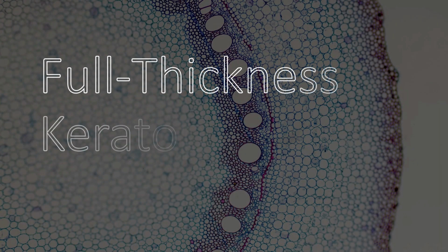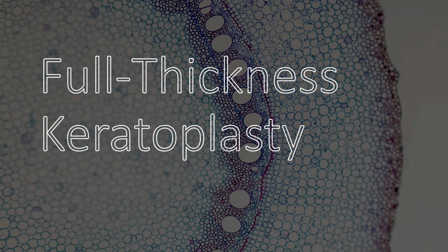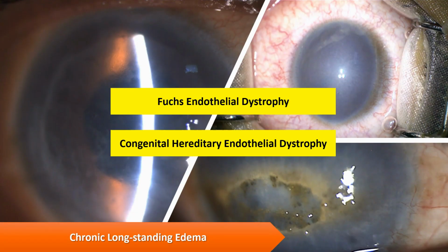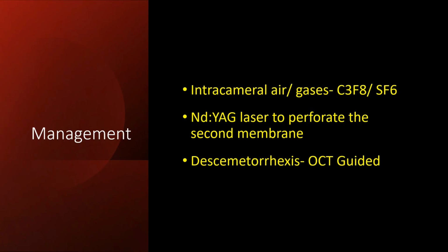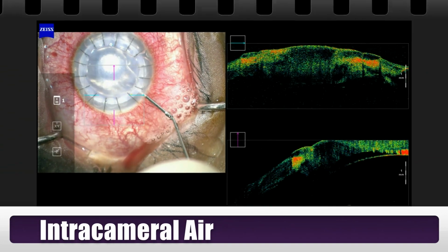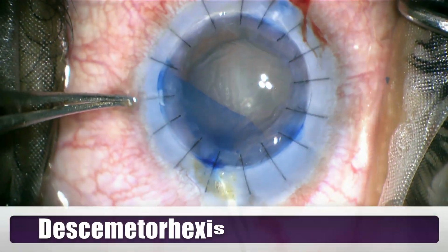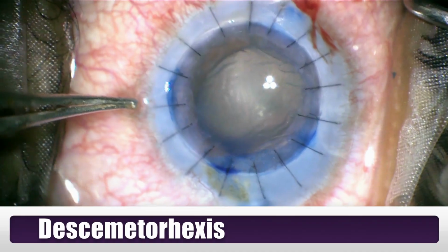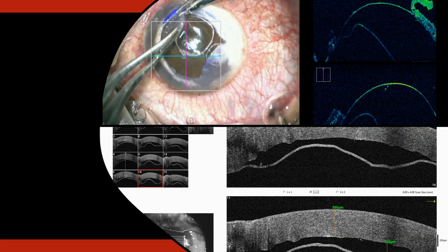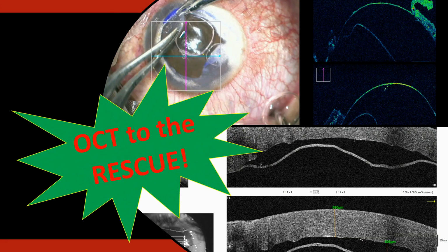Retention of the host Descemet membrane may be seen in cases of chronic edema undergoing penetrating keratoplasty, such as long-standing Fuchs endothelial corneal dystrophy or congenital hereditary endothelial dystrophy. Management may be challenging, and options include injection of intracameral air or gas or descemetorhexis of the retained Descemet's membrane. We describe two cases with double membranes in the immediate postoperative period and the role of OCT in their management.